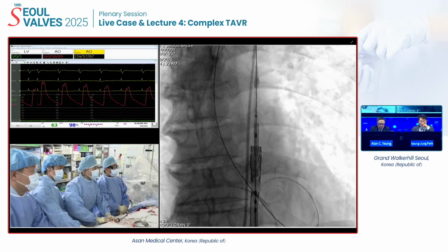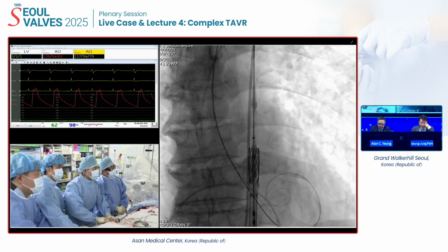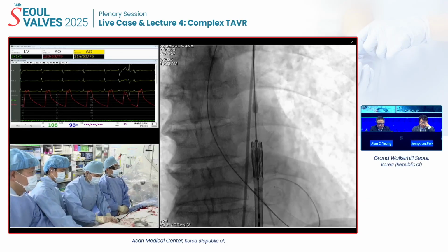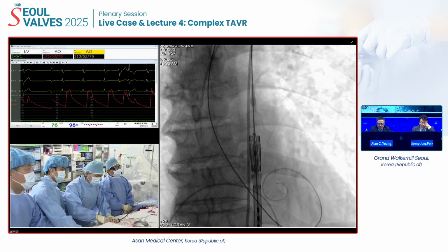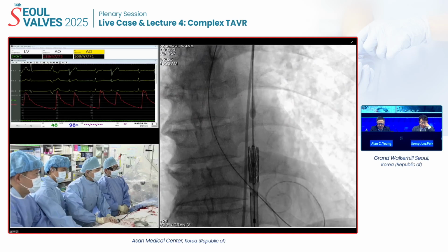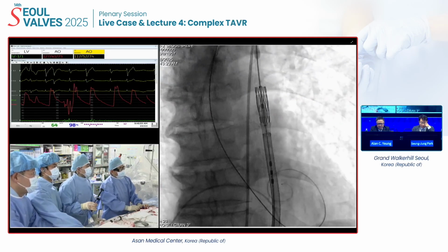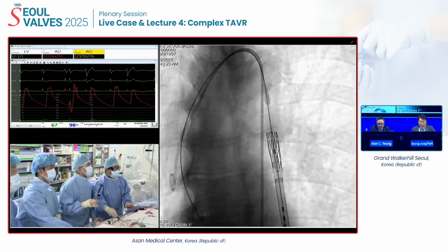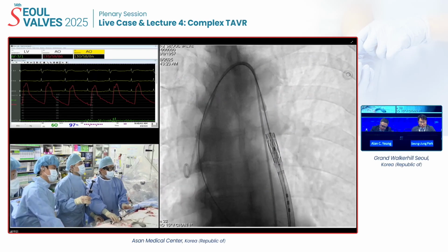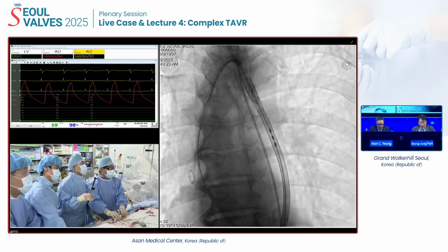As far as I know, in the two randomized trials, there are some bicuspid patients, but in a subgroup analysis, even in the bicuspid cohort, the cerebral protection device didn't show any benefit. Correct. Definitely the cerebral protection device can capture some debris during the procedure, but we need a further study, at least an observational study, to identify the best target for the cerebral protection device.